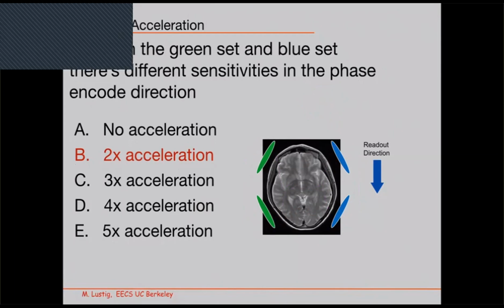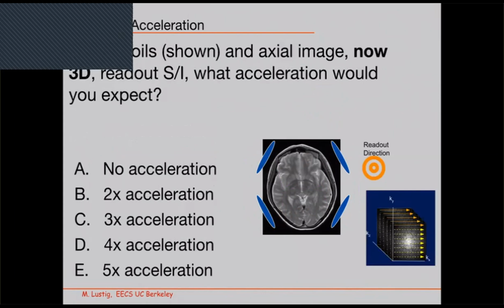Okay. All right. Can I ask a question? Technicians don't really think about reconstruction, or do they? Why does a technician need to think about parallel acceleration factor? Because they're going to prescribe that. They're going to prescribe a scan, and they're going to prescribe the amount of acceleration that they want to use, and they need to prescribe the right direction of acceleration.